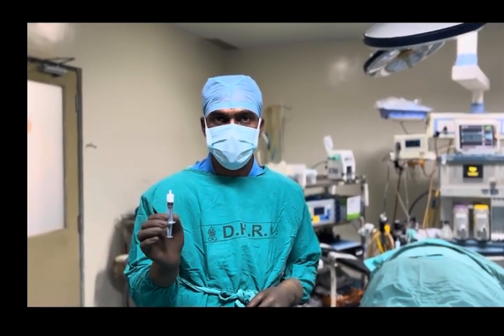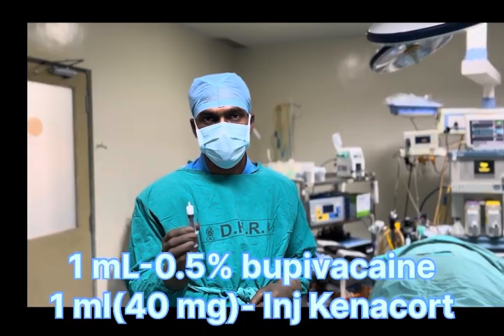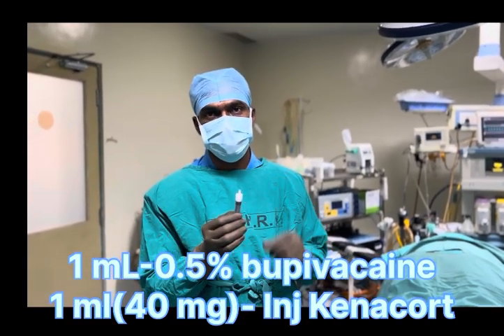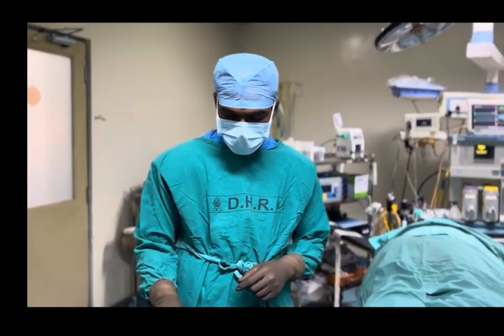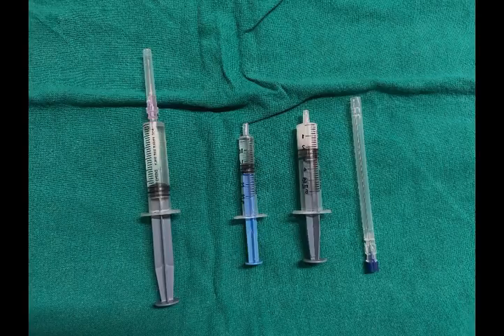And this is a 5 cc syringe in which we have taken 0.5% bupivacaine 1 ml, and then injection Kenacort, which is 40 milligram, and the total volume is 2 cc, and then a 23 gauge spinal needle.